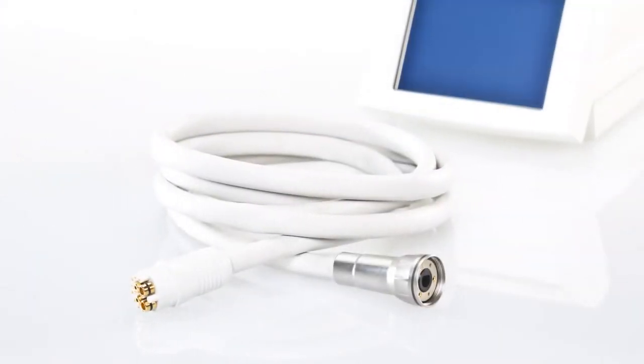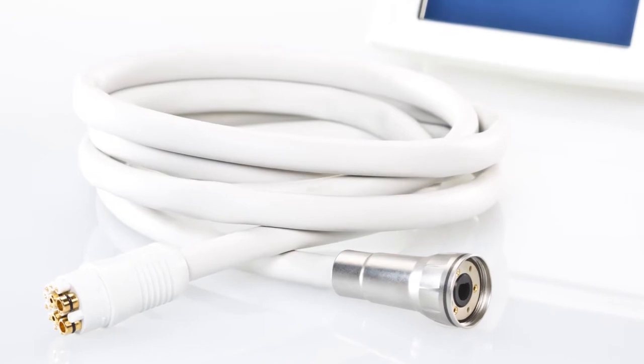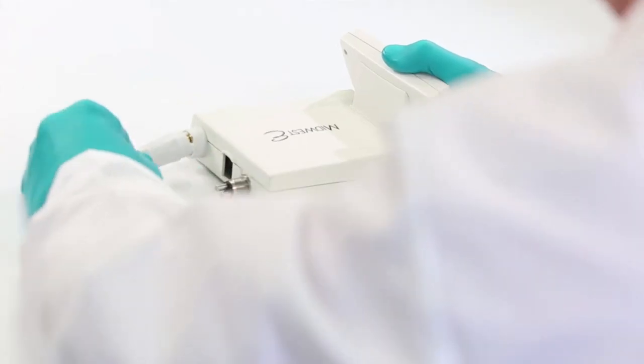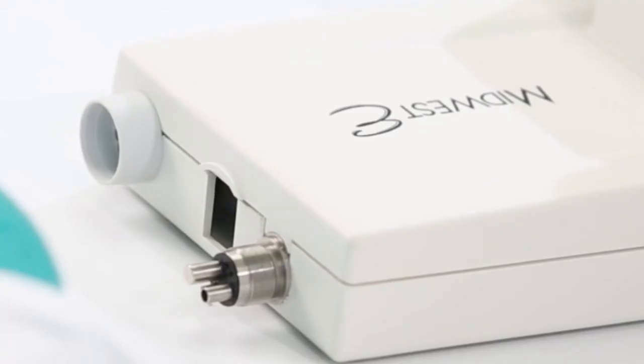A feature of the Midwest E is a user-replaceable hose. To install the motor hose to the control unit, locate the attachment point, line up the internal connectors of the hose with those on the control unit, and then simply push the hose onto the fitting.